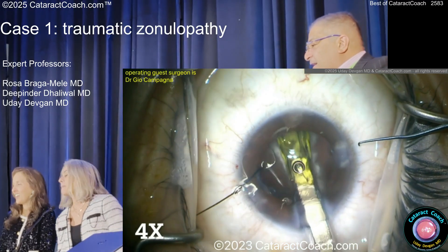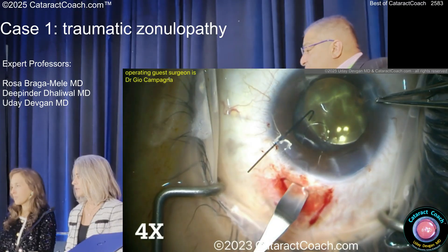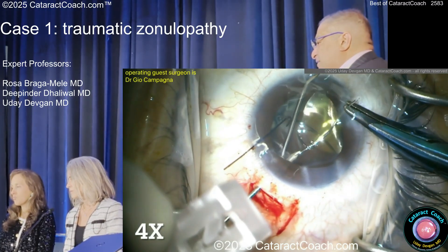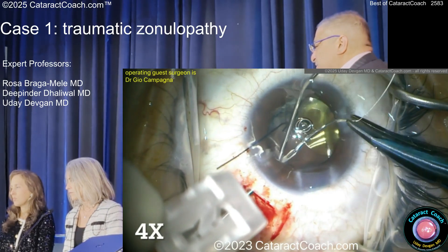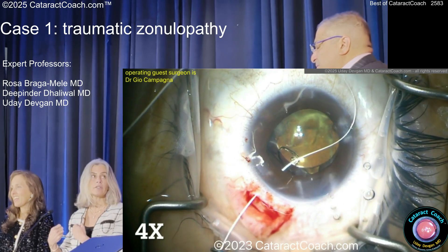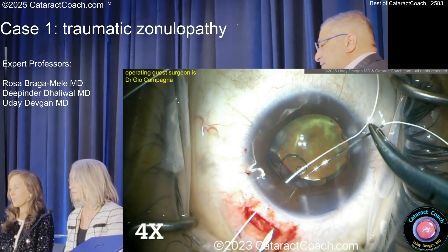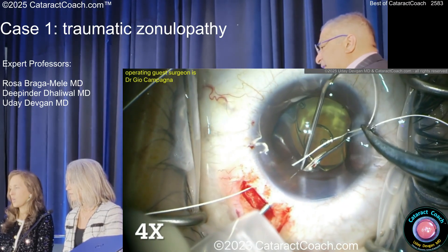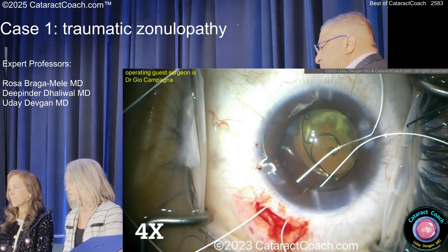Now how are we going to fixate that eyelet to the sclera on the segment? Gore-Tex. So people in the past used 10-0 polypropylene, but we found that breaks. So here comes the Gore-Tex. The Gore-Tex is that CV-8 needle — it's meant for cardiovascular surgery. It has the name CV-8 on the needle, so it's apparently 8-0. Any pearls for working with this? I find Gore-Tex to be so slippery and slick. I would have probably straightened that needle out a little bit ahead of time so it's easier to pass. Because now it's curved, it's a lot tougher to pass. I like the scleral groove there — and now poking in and guiding with the hypodermic needle, guiding the 8-0 CV-8 out of the eye. This is really slick and slippery, so you have to make sure you're not too square and that it's properly cinched down.